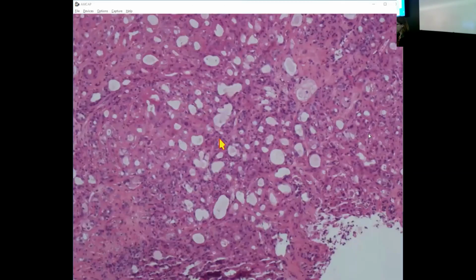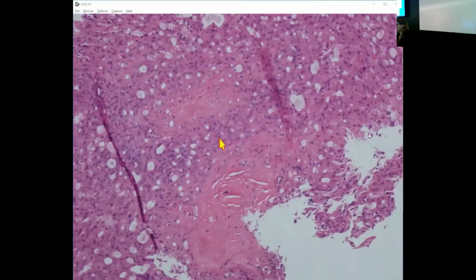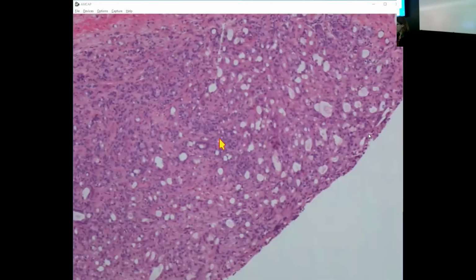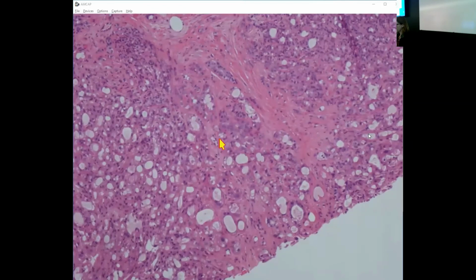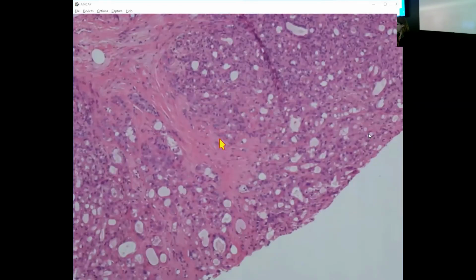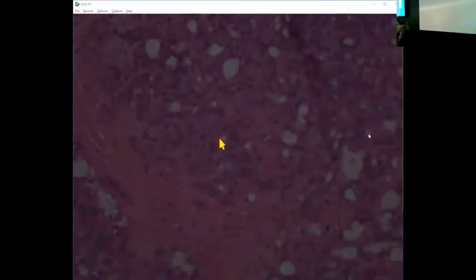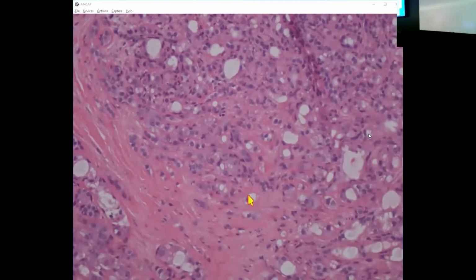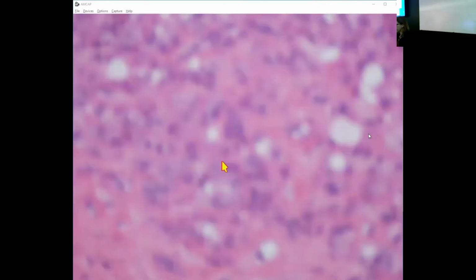So I think that's a reasonable consideration. But I thought, based on this edge up here, of adenosis. And because of the differential diagnostic consideration, we did myoepithelial cell markers, and they were present throughout, and you can actually even see myoepithelial cells just in here. If I go on higher power, maybe.